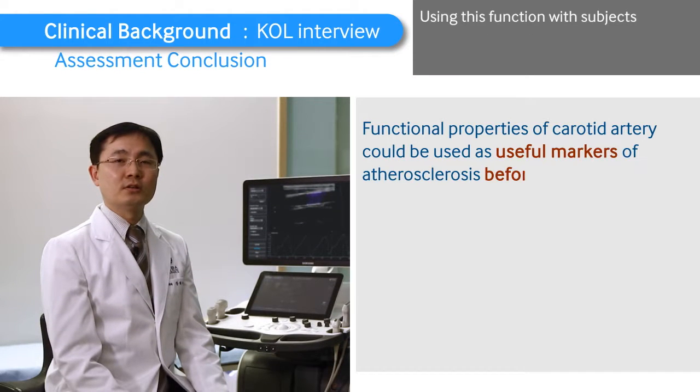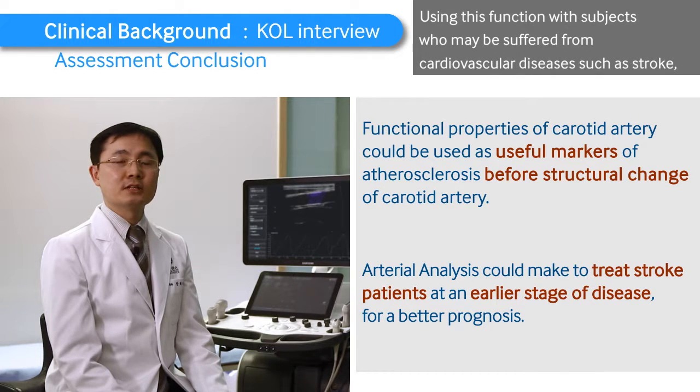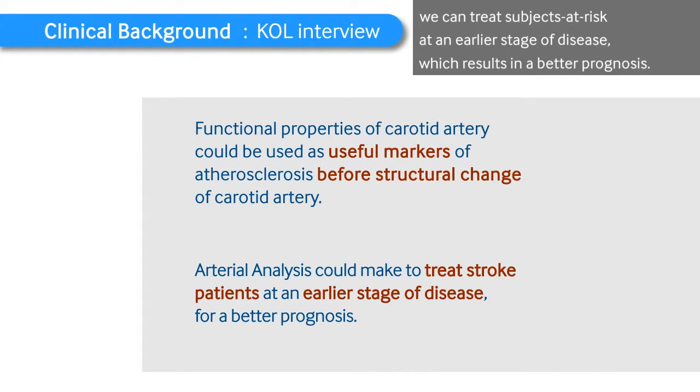Using this function with subjects who may be suffering from cardiovascular diseases such as stroke, we can treat subjects at risk at an earlier stage of the disease, which results in a better prognosis.